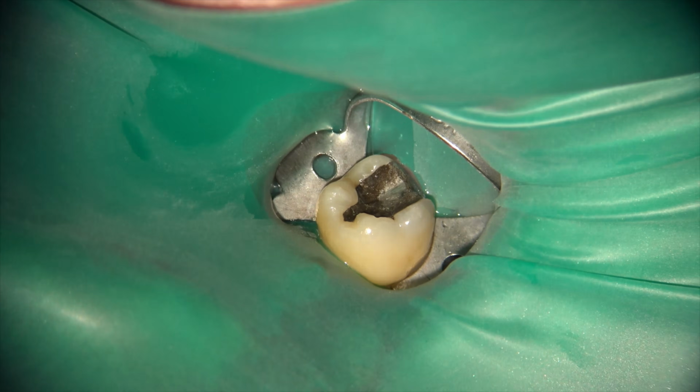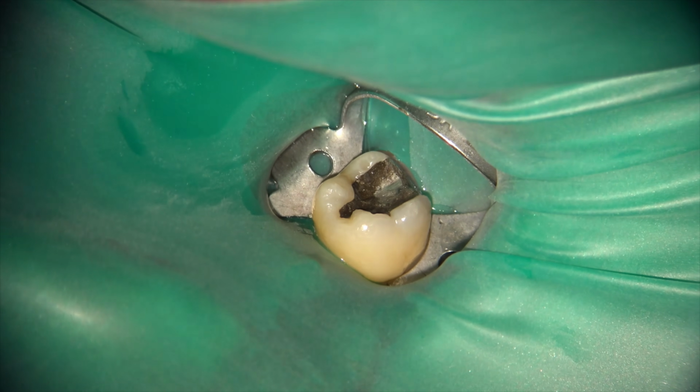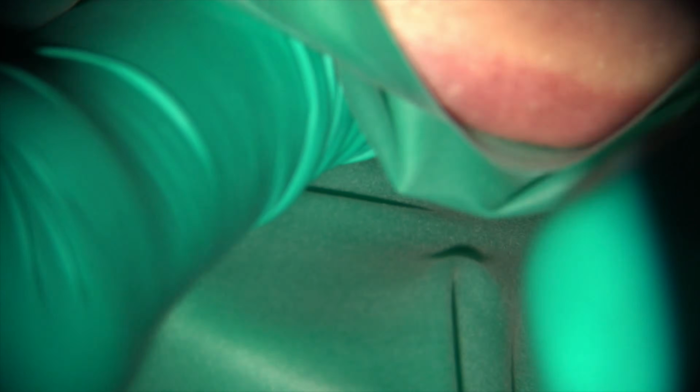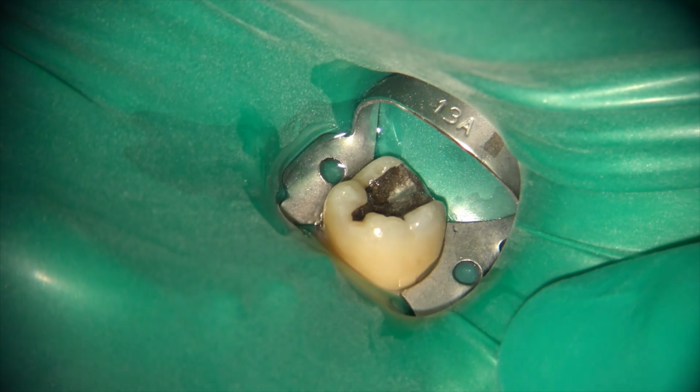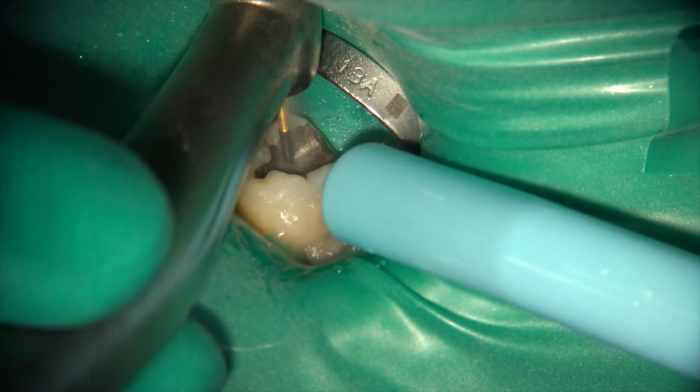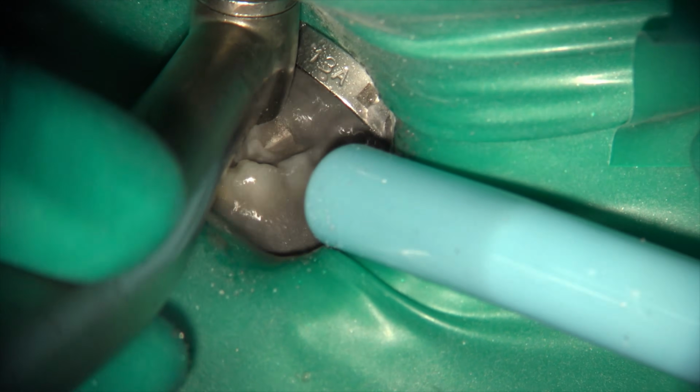In this case, I use a rubber dam, and I just want to also share with you this technique that I've learned, in which, after having your primary rubber dam isolation, if you need more isolation and a little bit tougher rubber dam push, and you don't want to go to a heavy gauge, you can add another rubber dam to your existing rubber dam.